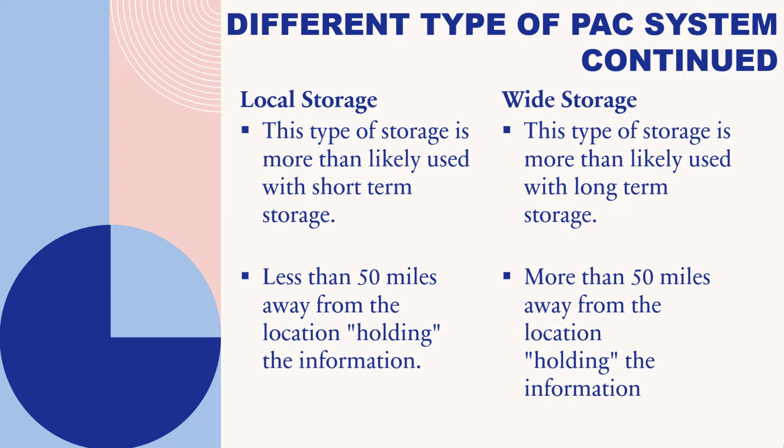Wide storage and long-term storage are normally larger server farms that are like a mass server farm of a lot of information, whereas local storage and short-term storage are kept in a smaller storage area that is a lot closer to the facilities.